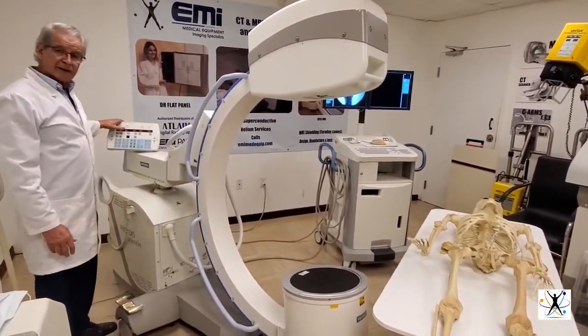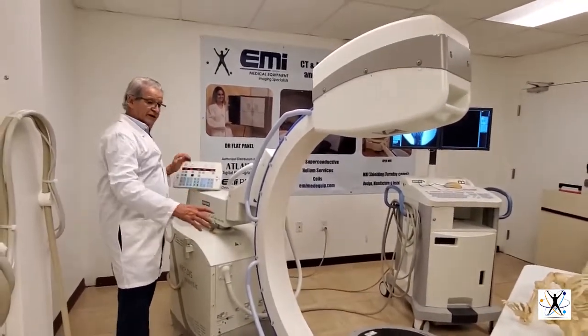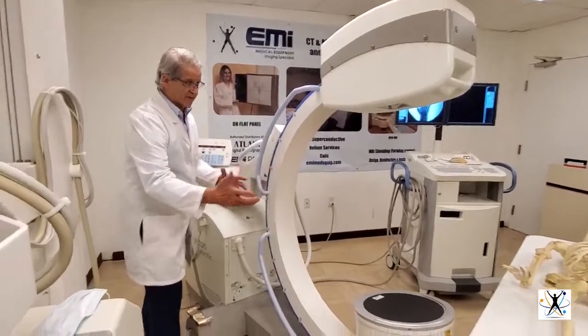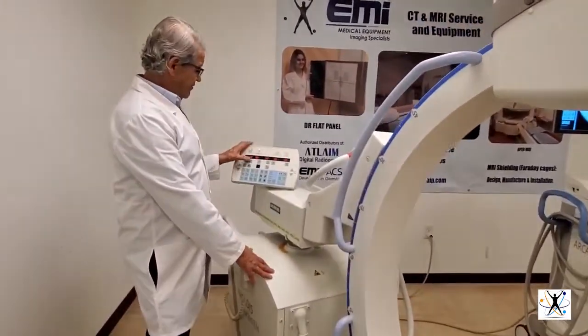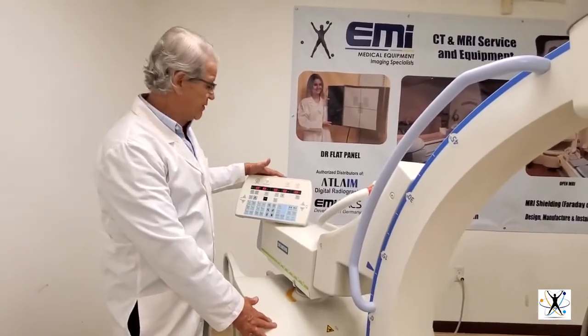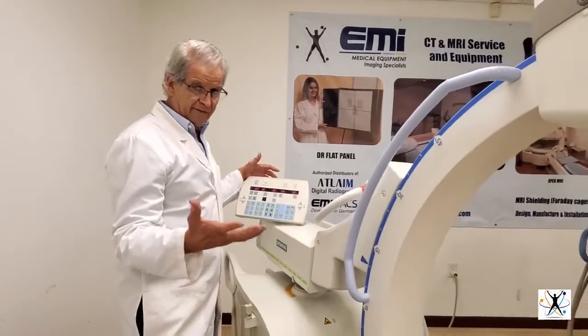This is the control panel where you have all the controls for size of the image, for the kilovoltage, and for the milliamps of the X-ray generator. It also has automatic values.